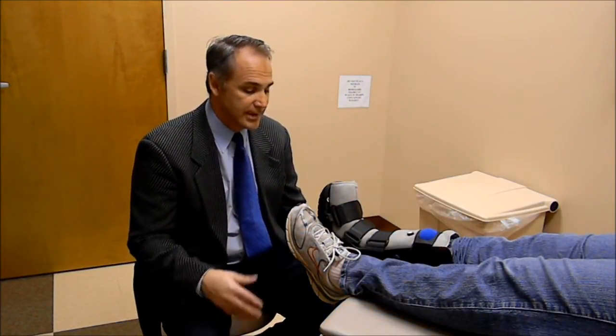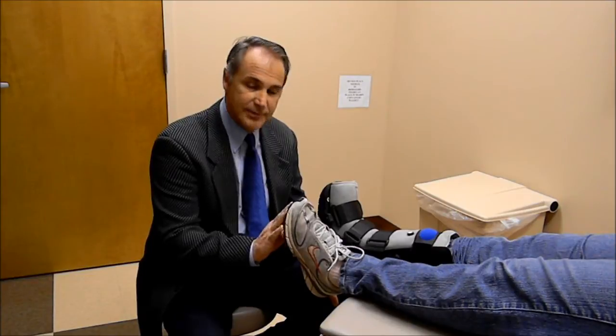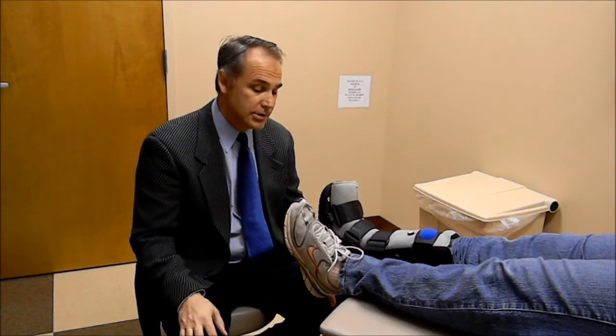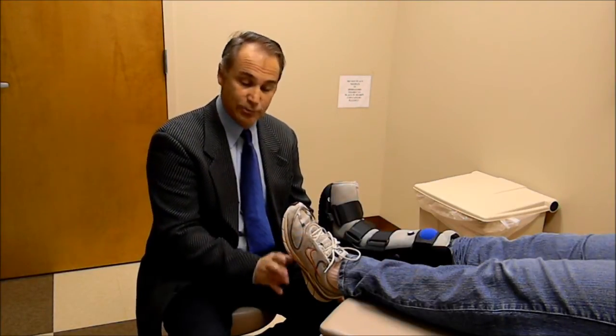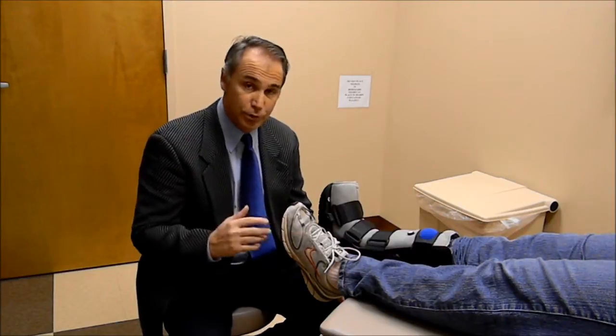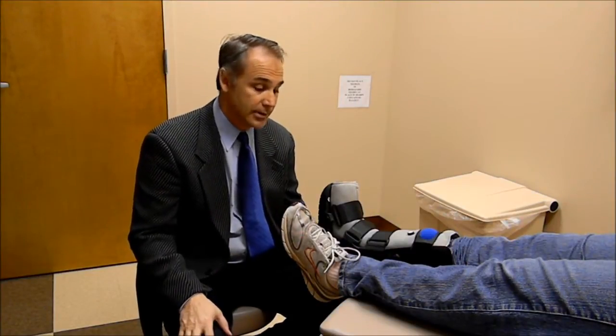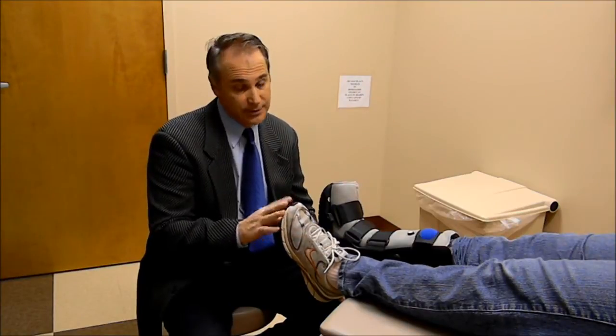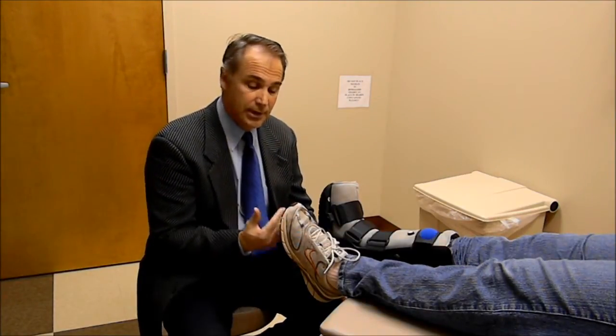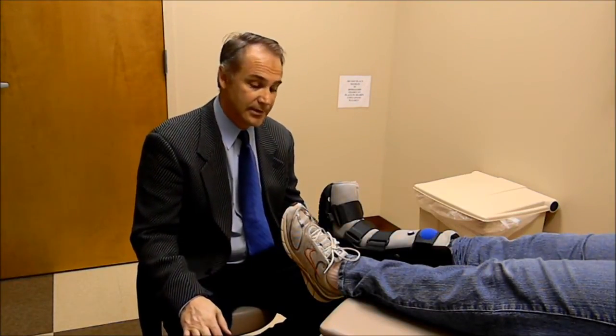What we used to do in my practice was have patients go to the shoe store and have a sole glued onto the bottom of the shoe. It worked very well. The problem was it was very expensive, it basically ruined the shoe, and patients weren't going to pay to have that sole removed once they were done with their fracture boot therapy.